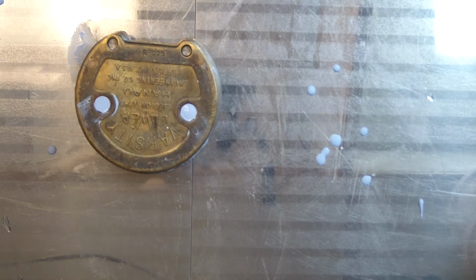depending on what kind of set you get, 20 minutes to whatever. So I'm just going to put this aside, and through the magic of television I already have one that's been flasked and boiled out. Let me just wash my hands real quick and I'll grab it.